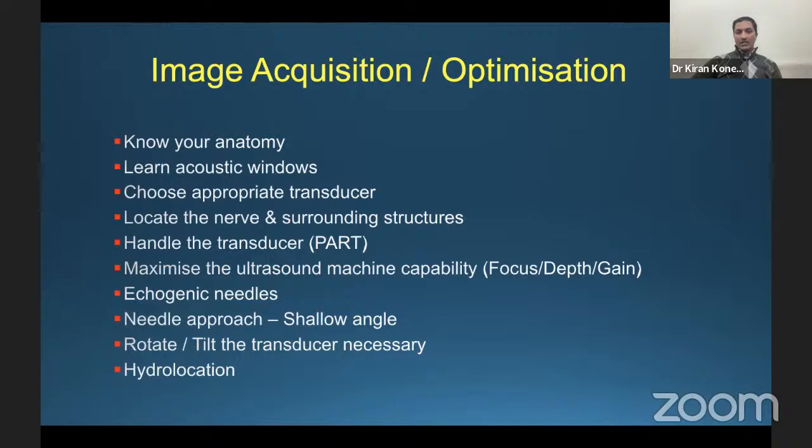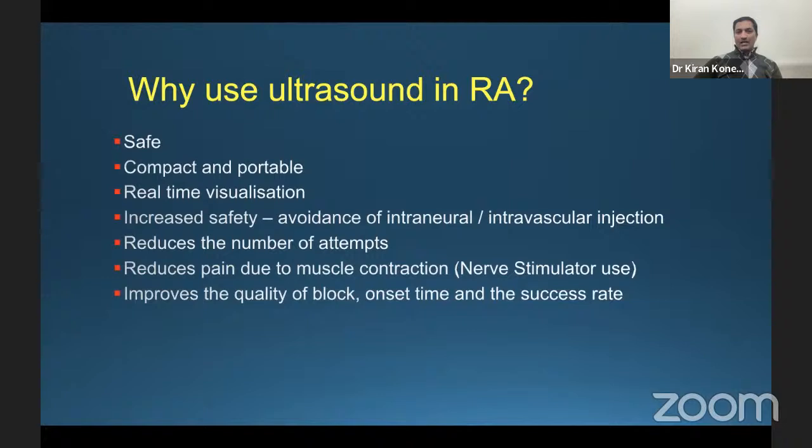So I hope with this, I have given you enough information, and also convinced you enough to use ultrasound in your regional anesthesia techniques, as it's usually safe to use ultrasound in them. And it's also compact and portable in most areas. It is available to that extent. And there is real-time visualization of both the anatomy and also your needle track.